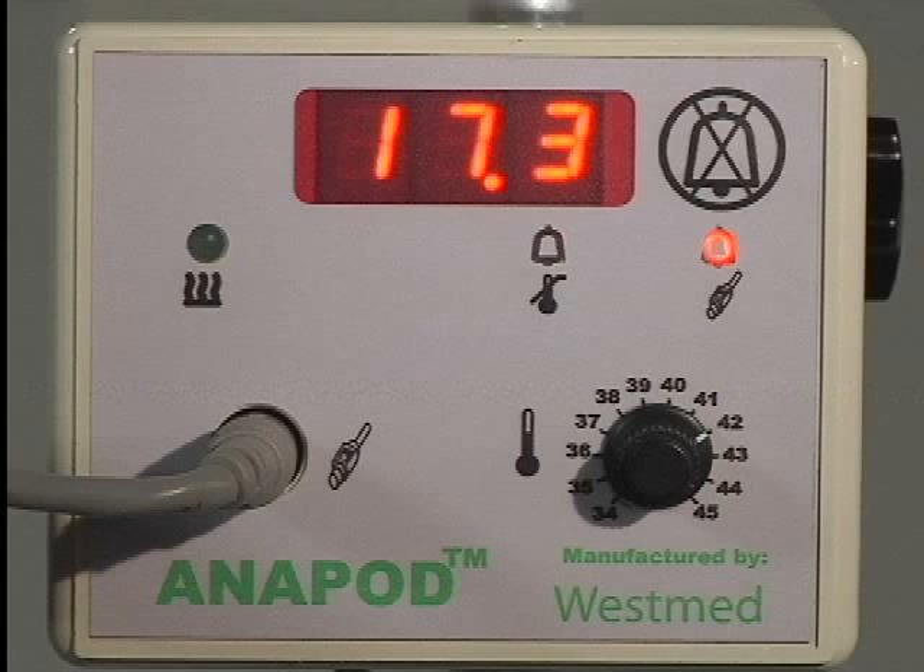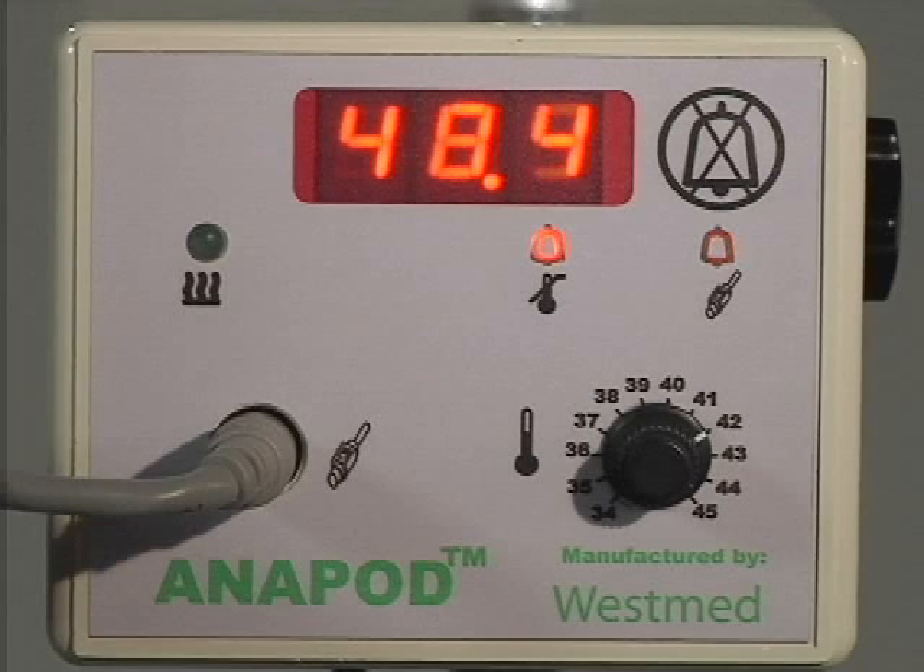Probe sensor alarm: indicates the heated wick circuit has malfunctioned or is not connected. Over temperature alarm: indicates the wick circuit internal temperature probe has detected temperatures at or above 47.5 degrees centigrade.